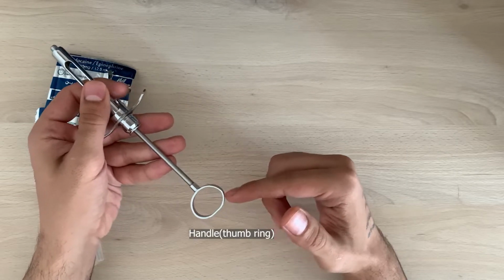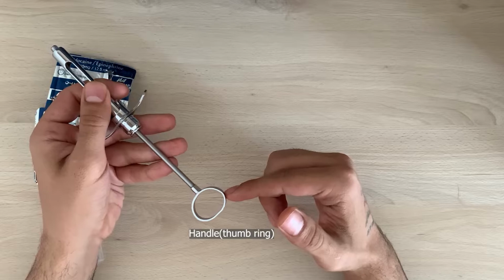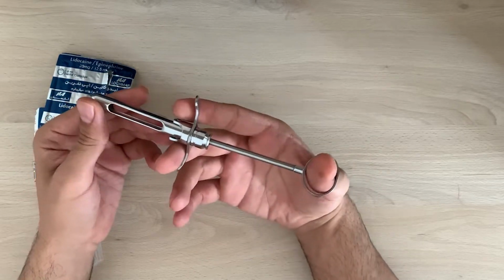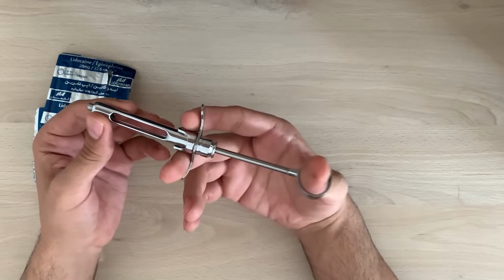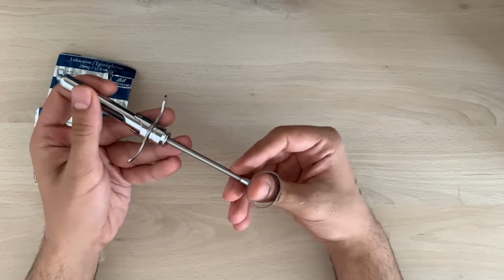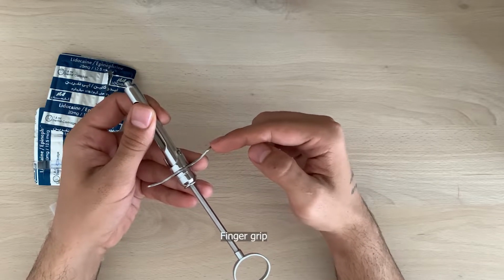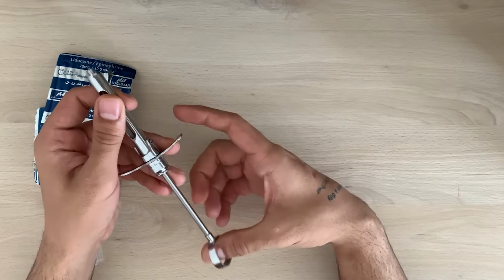This part is the handle or thumb ring, with which dentists can control how the syringe will move, and it's used to push toward the carpule. This one is a finger grip, which helps to control the dental syringe better.